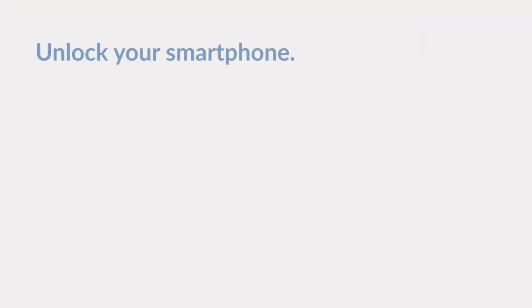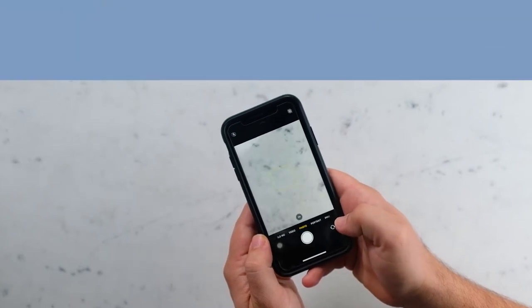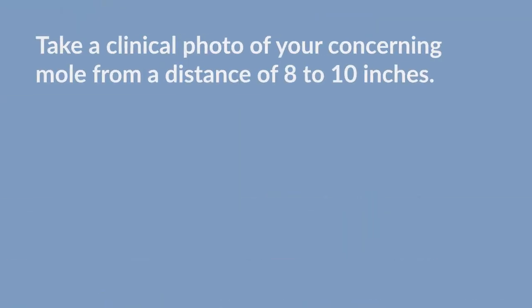Unlock your smartphone and open the camera app. Take a clinical photo of your concerning mole from a distance of 8 to 10 inches.